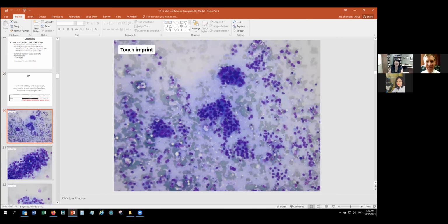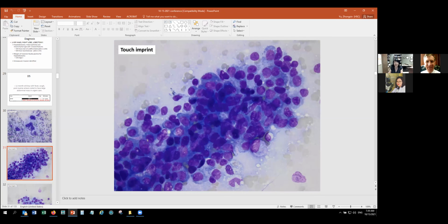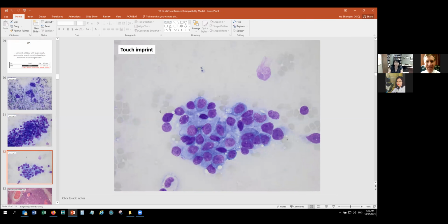So any time you deal with a liver tumor, we have a consensus with surgeon and oncology: anytime we do this kind of biopsy, submit fresh tissue. We do a touch imprint to make sure we have adequacy, enough tumor. The touch imprint looks like a cluster of small blue cell tumor, high NC ratio, with epithelial appearance. We don't try to make a diagnosis on the touch imprint, just like cytology, just triage the tissue and make sure you have enough.